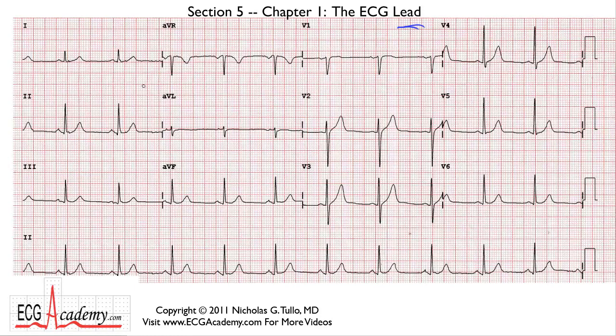We're going to talk about the basics, because when you look at a 12-lead ECG, you see these lead 1 and lead 2, and on monitors there may be a switch that you can change which lead the monitor is looking at, and what lead you pick is going to have an effect on the way the ECG looks.